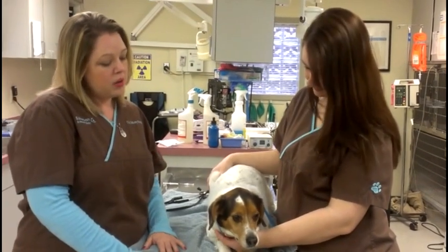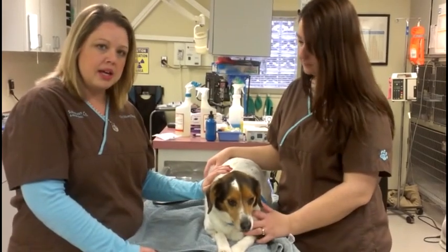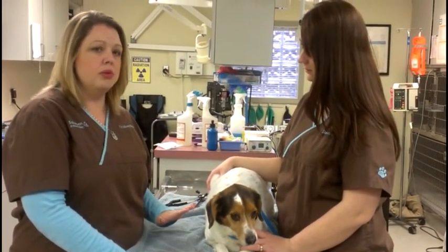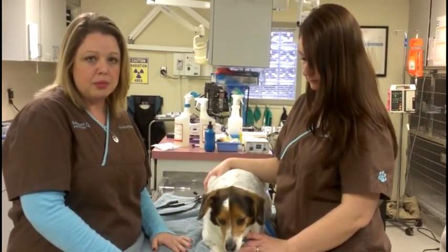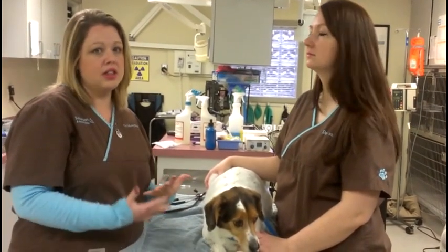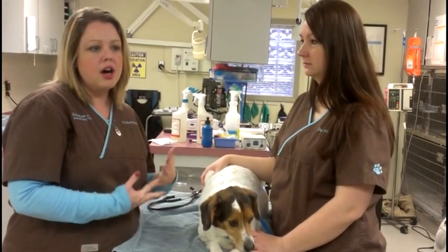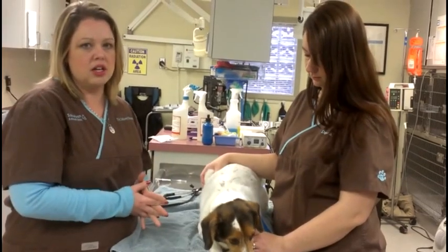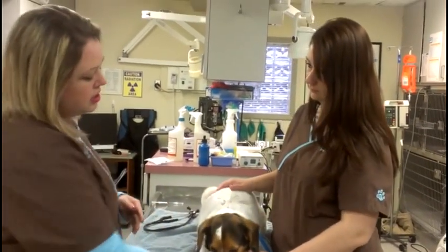So right now we're going to start with our preoperative exam. We do this on every patient when they come in prior to anesthesia. She's already had her blood work done, but if she hadn't, we would go ahead and draw a blood sample at this point, to make sure her liver and her kidneys and everything are working properly before we put her under anesthesia. Basically because those are the organs that filter out the anesthesia and all the medications that go along with it.